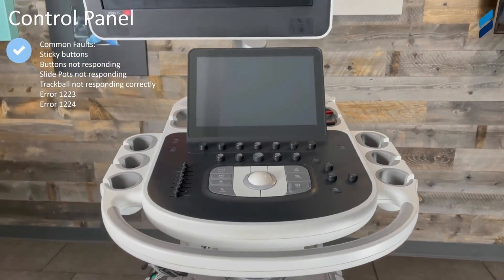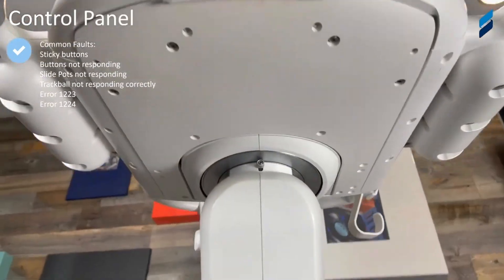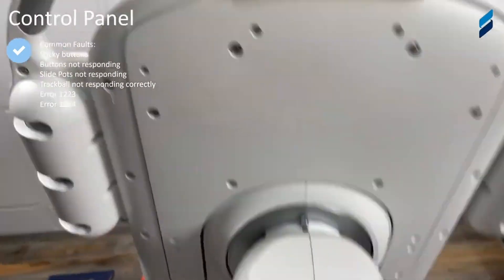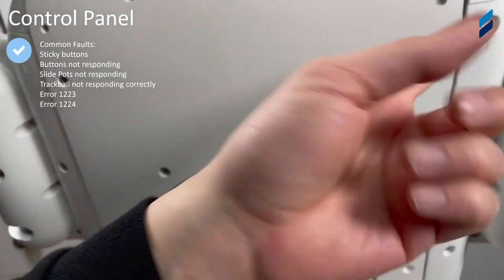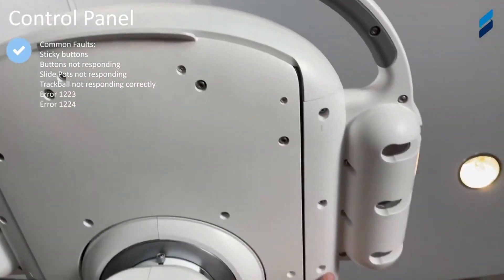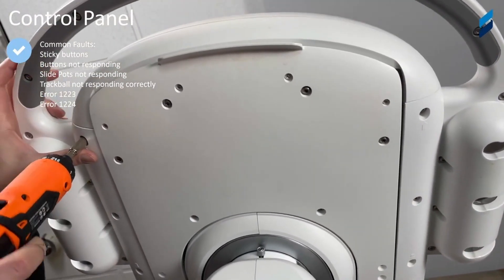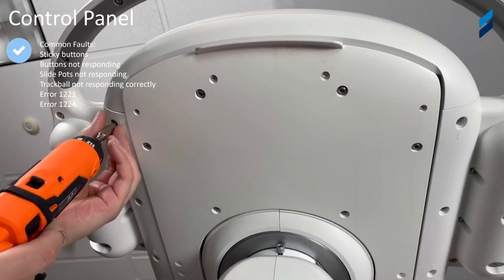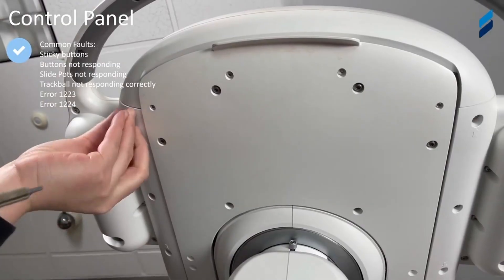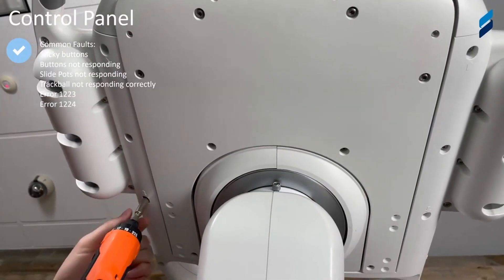We now have the control panel and trackball. Common faults include sticky buttons anywhere on the control panel, buttons not responding, slide pots not responding correctly, and the trackball not moving correctly with your mouse cursor on screen. Specific communication errors the control panel will experience are error 1223 and error 1224, which will show up on the monitor as a fault.